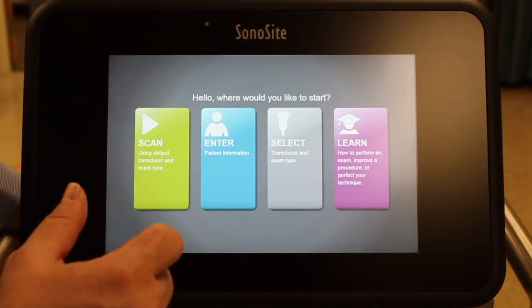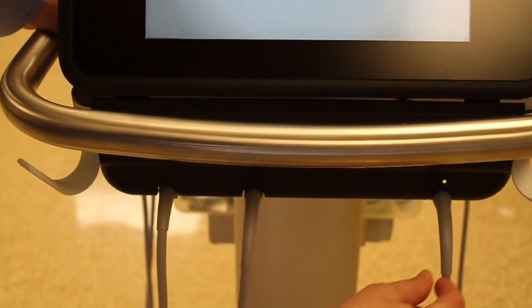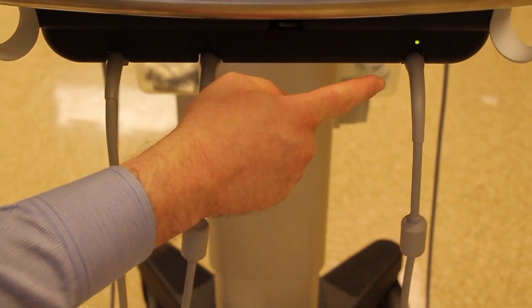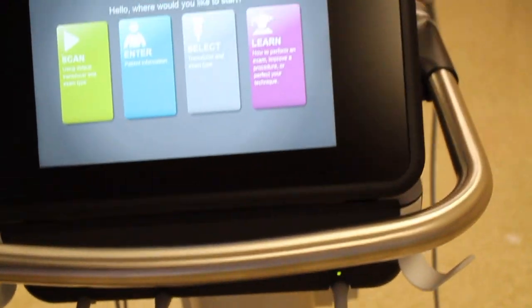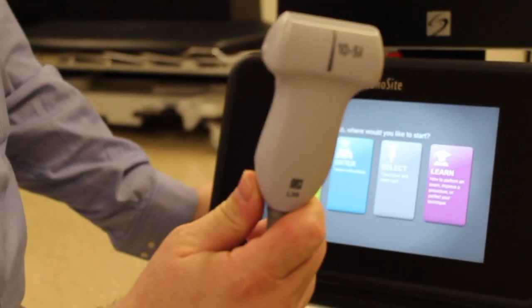You may want to play around with the Learn tab on your own, but primarily it'll be either select or scan. If we look down below, there are three cables which are connected to three different transducers, and there's a light. Right now the light is on this cable, and if we follow that back, that's going to go to our 5 to 10 megahertz linear probe.